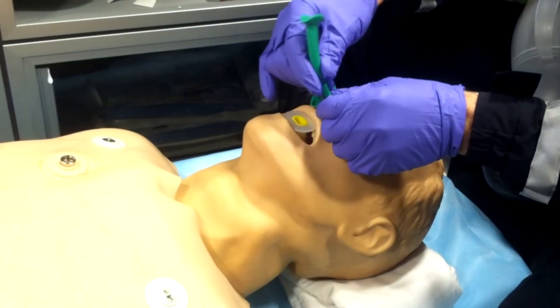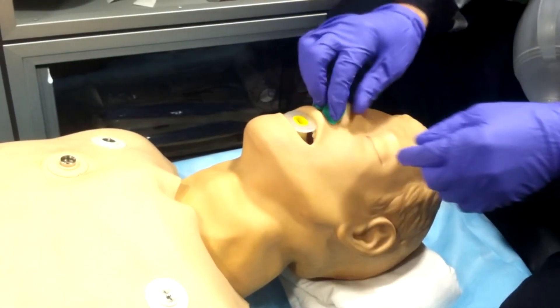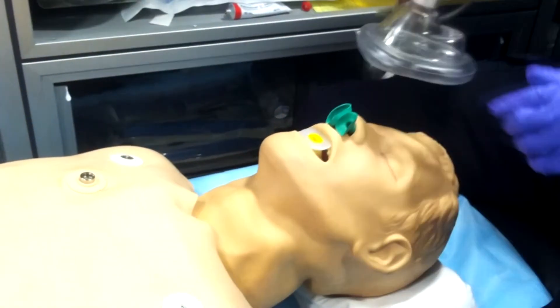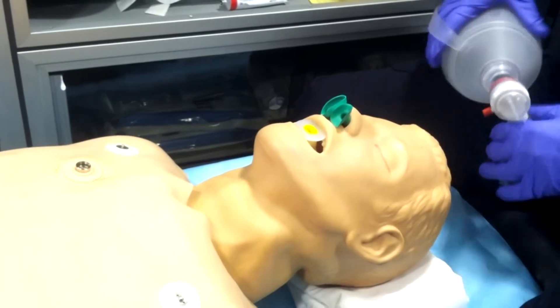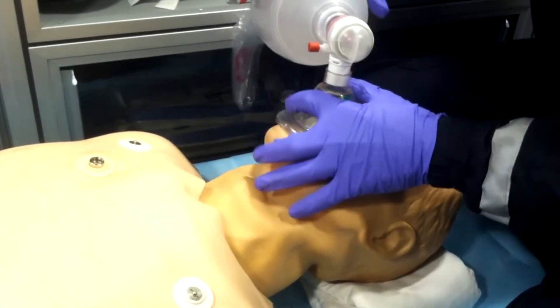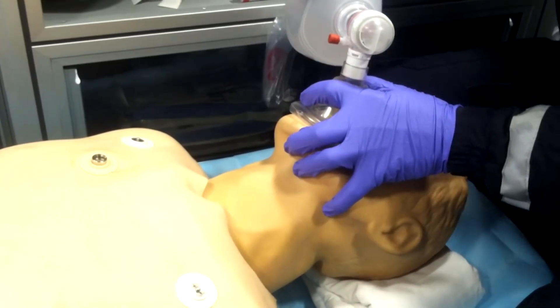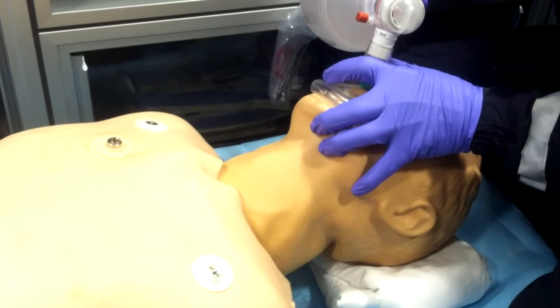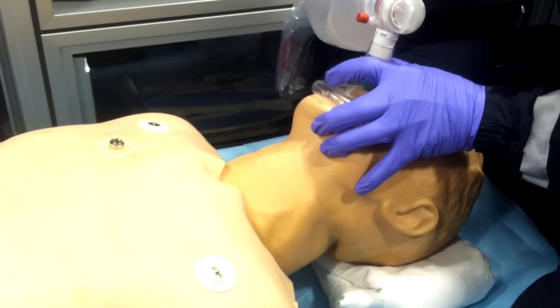The best way involves the use of three adjuncts when ventilating somebody: two NPAs, two nasal airways, and one OPA. You can see he goes right back to the EC clamp technique — the one-handed technique — which is good, but there is an even better way to bag somebody that we're about to go over.